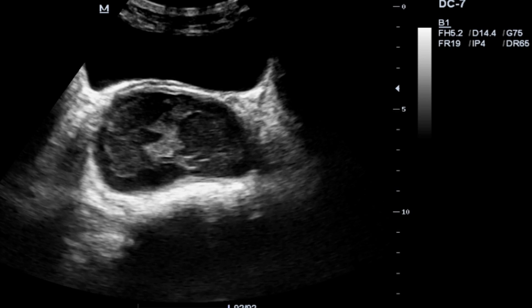There is a condition called a true hermaphrodite, also called an ovotesticular disorder. In this type of disorder, you actually see both the testicular portion and the ovaries in the same individual.